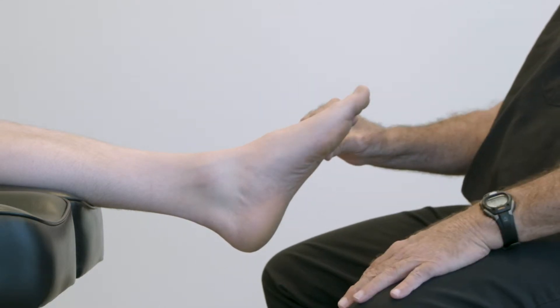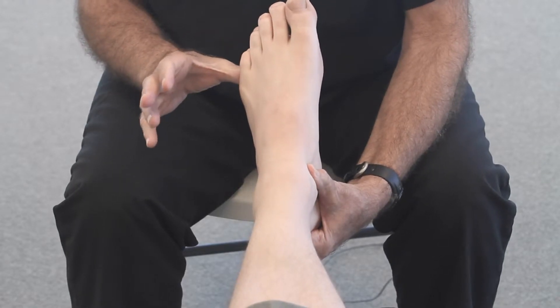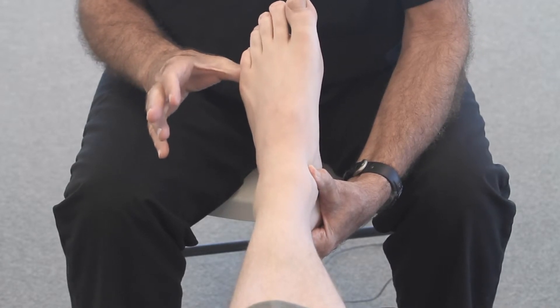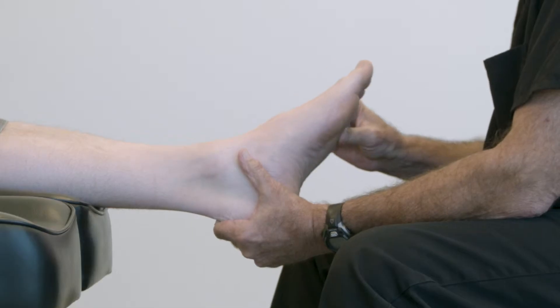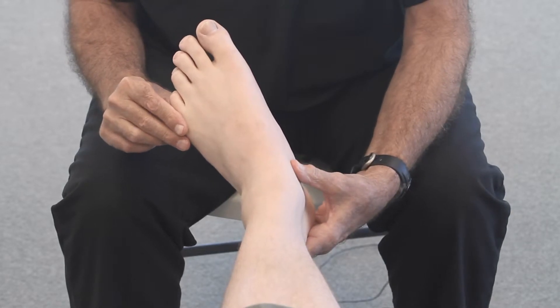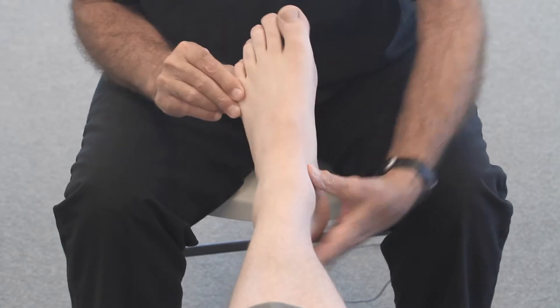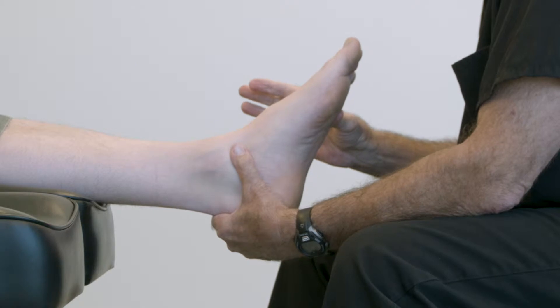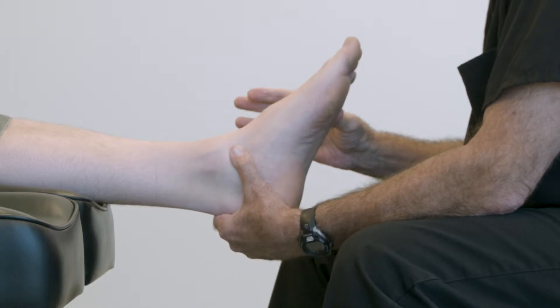We want to capture the foot in subtalar neutral because we want the mid-tarsal joint stable — we want it stiff and solid. If we cast the foot pronated, we've got a very loose, unstable mid-foot. It's really a good idea to demonstrate that to a patient so they understand what you're doing as a practitioner when you align the foot to subtalar neutral and load or lock the mid-tarsal joint. This is how we want the foot to function with the custom device.